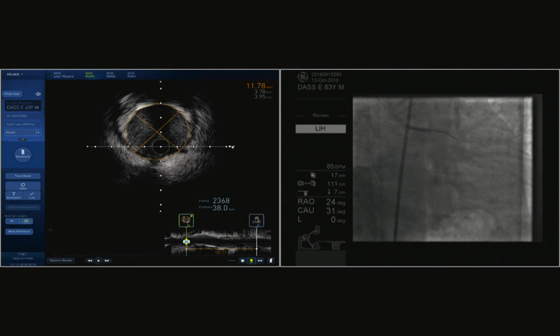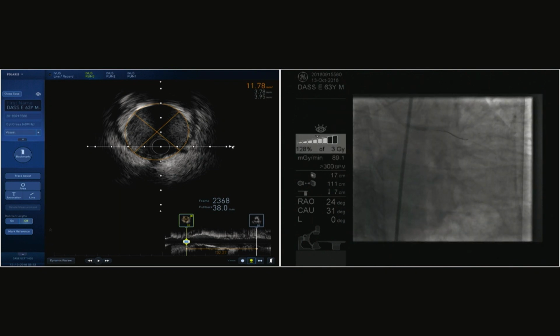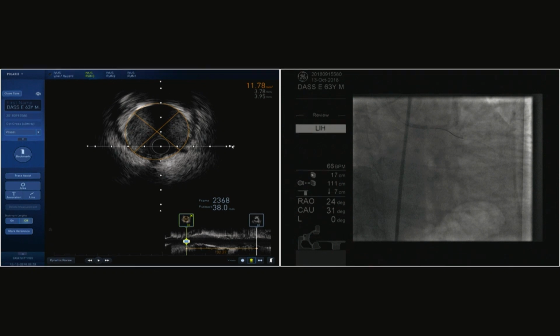And of course, proximal LAD seemed to be a little bit underexpanded. So he made another dilatation. Dr. Hirata, after the last IVUS, what was the stent area at the level of the left main bifurcation? Left main bifurcation. Okay, so just do all the MSAs. Yeah, left main bifurcation. Balance it out, zero it, equalize.